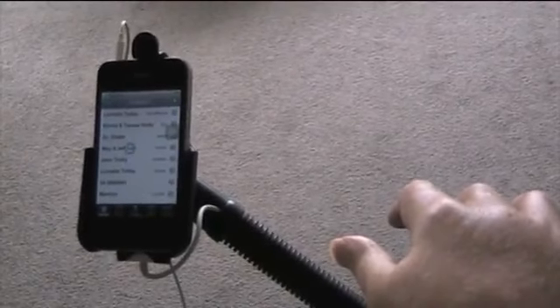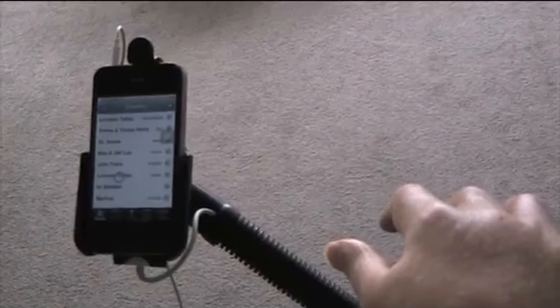I've only been using this for a short time, but it's proving to be a lot faster for jobs where I need to move to a certain place on the screen quickly instead of going through all the different menus. So I move the cursor on the screen to where I want, the phone number, dwell there for a few seconds, and then click using my left hand pad, and that does the same job.